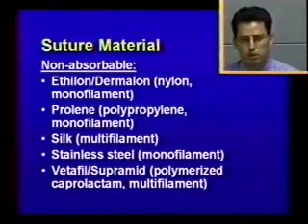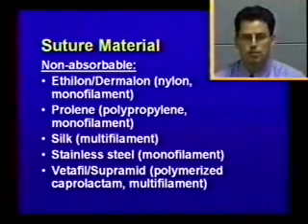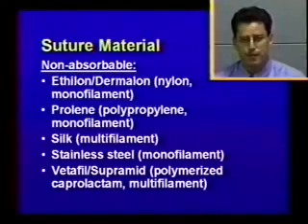For the non-absorbable suture materials, Ethilon or Dermalon is nylon. This is a monofilament. And then Prolene or polypropylene is also a monofilament. These are probably the most common non-absorbable suture materials used. We also will use silk, which is a multifilament suture material, for its handling characteristics in ligating vascular structures, and occasionally stainless steel, also a monofilament suture material.